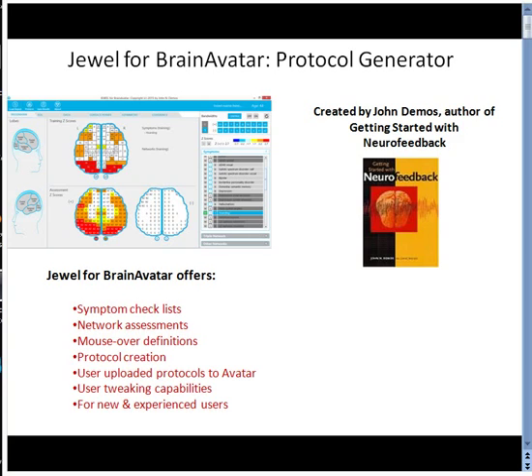It offers symptom checklists, network assessments, mouse-over definitions of all Brodmann sites, protocol creation capabilities, user-uploaded protocols for Avatar, and user-tweaking capabilities. Consequently, it is suitable for both new and experienced users.